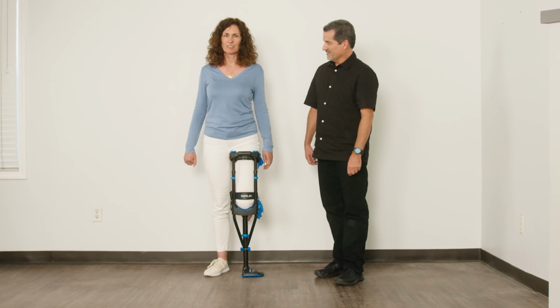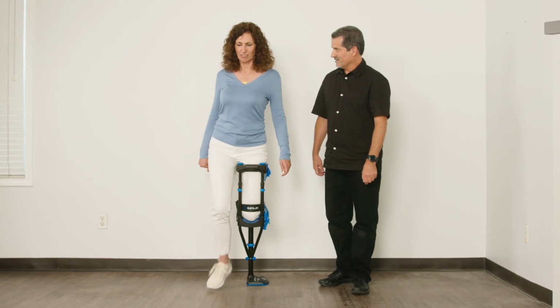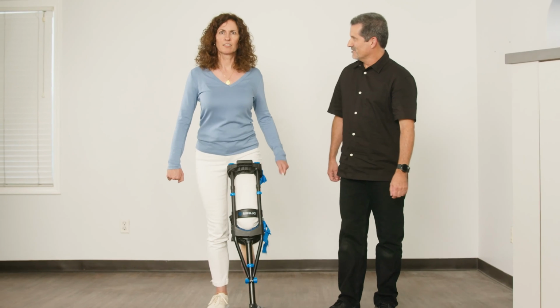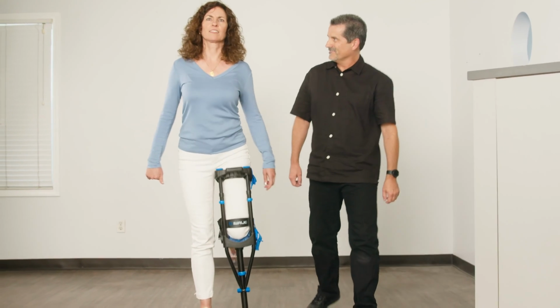Common issues. These are common mistakes that patients make while learning. Looking down. People don't look down when walking normally, but your patient will. Everybody does. You need to constantly monitor for this and correct it whenever it happens.